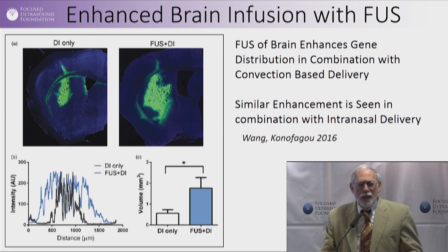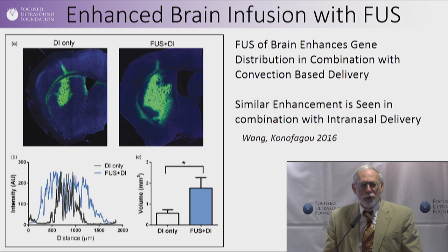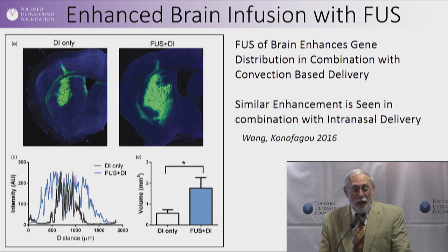As I mentioned, there really is a barrier within the brain. So the space between the cells is not purely liquid, it's kind of a gelatin. And that's also what limits even direct brain injection. But focused ultrasound can not only open up the blood-brain barrier, but it can take, in this case, particles or genes, or in this case, viruses, and agitate them and actually increase their spread through tissue. So on the left, that's an injection without focused ultrasound. On the right, and represented by the bar graph on the lower right, there's much more extensive spread of the therapeutic throughout the brain from a single brain injection.